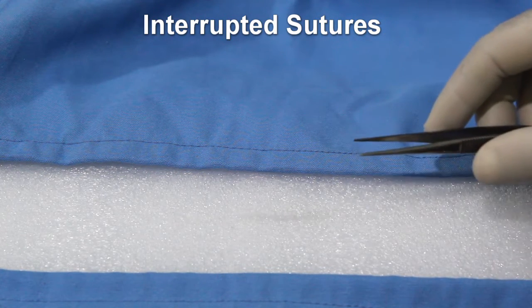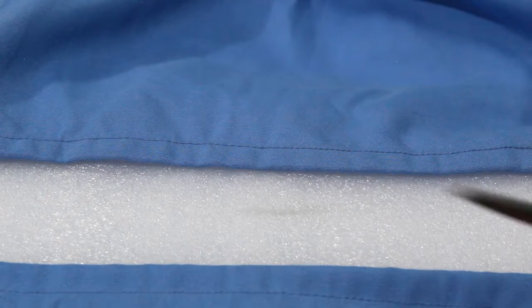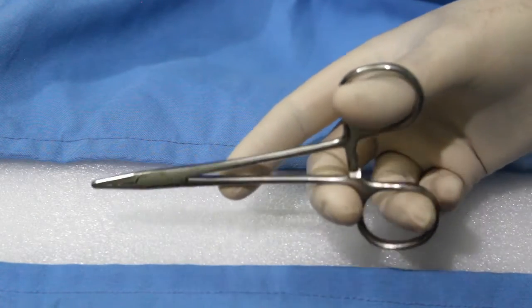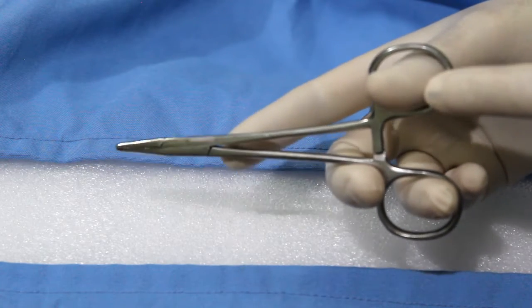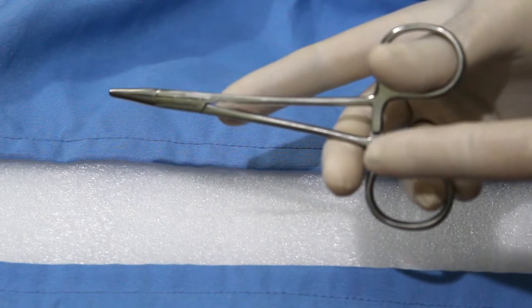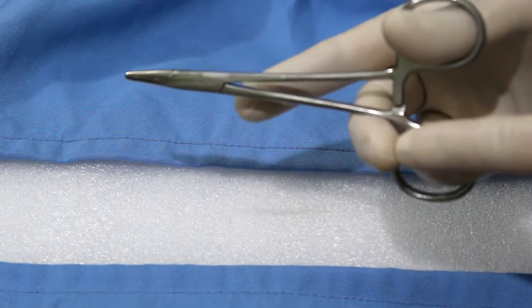The basic instruments you need for suturing: one is a needle holder. When holding the instrument, use a three-point control — that is three points of contact. One is the thumb, the next is the ring finger, and also the middle finger as a stabilizer.